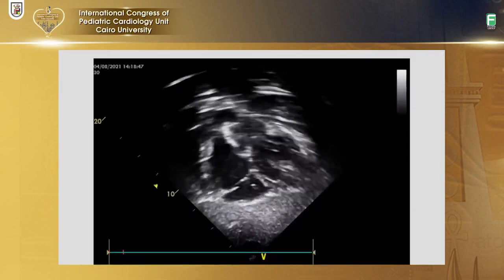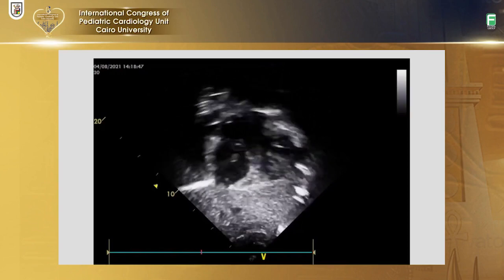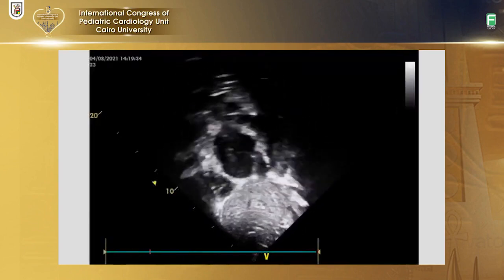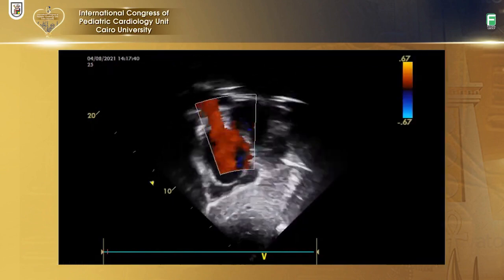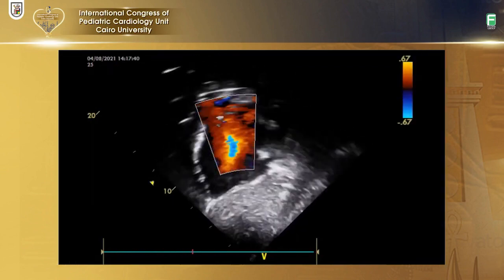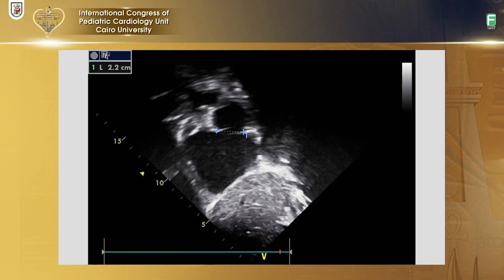Transthoracic echocardiography will start by subcostal four chamber view. There is a large defect central in the septum. From the classic bicaval view, the defect is not appearing, but with some anterior angulation when we are approaching the aorta, the large defect appears by color Doppler with some modification of the bicaval view. And there is a still image by color. There is a still image by 2D when we include the flimsy end of the defect.